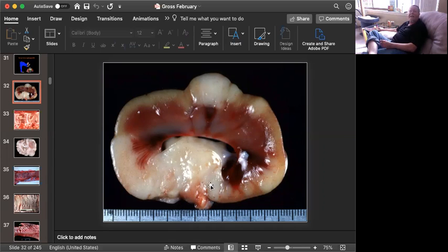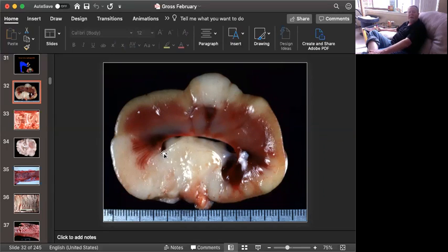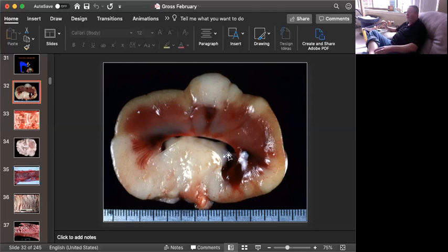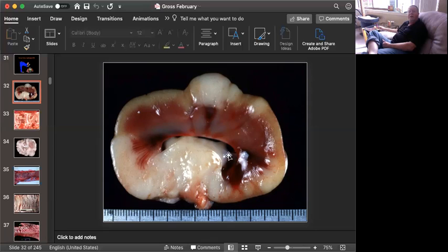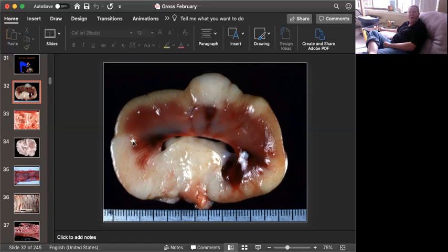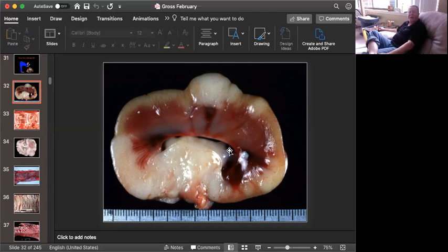We have some other lesions that are associated with it. We have multiple acute renal infarcts and we have hydronephrosis. So for full credit, renal lymphoma would be fine, but I want to make sure that you note these other changes here. Looks like we have an occlusion of a lobular vein at this point. This is an acute venous infarct. We probably have a couple more here, here, and here. And never forget, we have outflow obstruction causing hydronephrosis.